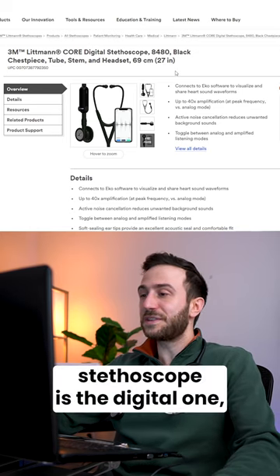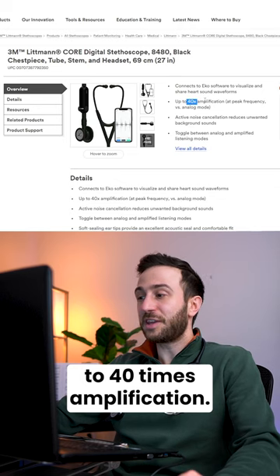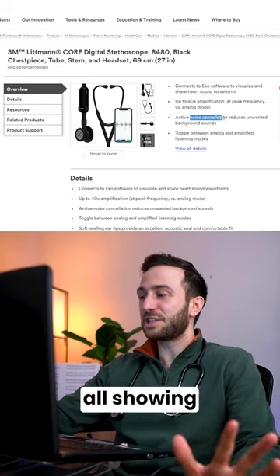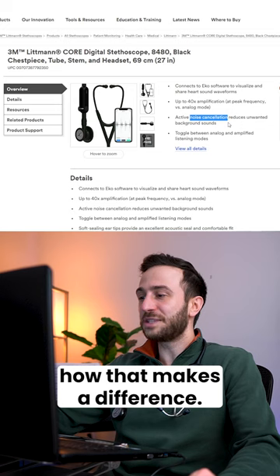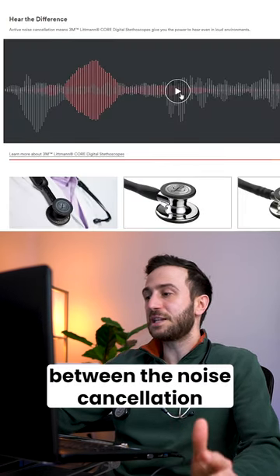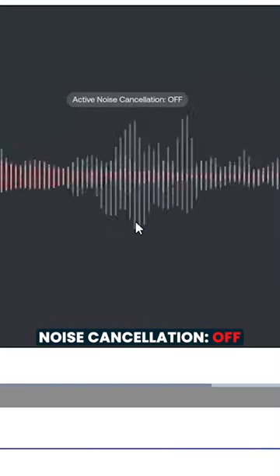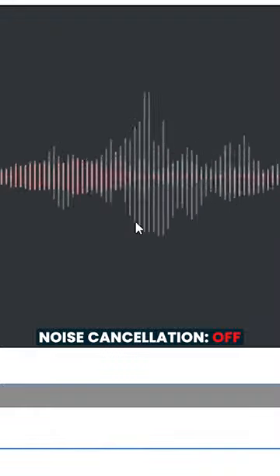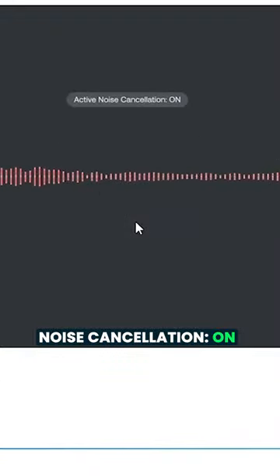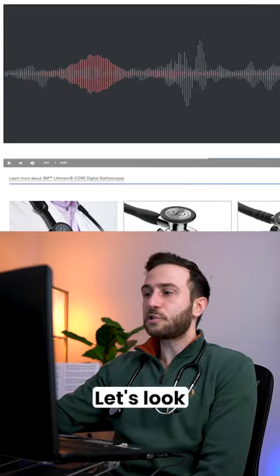The digital stethoscope allows up to 40 times amplification and has noise cancellation. I'll show you how that makes a difference — you can also connect it to an app. Here you can see the difference between the noise cancellation and no noise cancellation in the digital stethoscope.